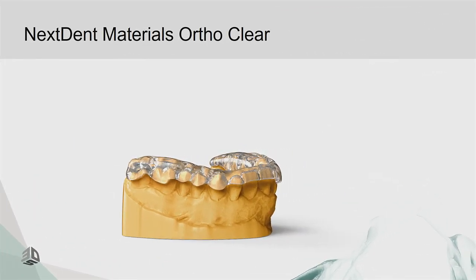Milling this takes quite some time. It's quite expensive. You have to buy expensive pucks. Printing this is the way to go if you ask me. You can print several in a row, just like the denture bases you see on the machine here. And within a matter of, let's say, 45 minutes, you're able to print 6 or 7 splints in one run. And that's, of course, way faster than any printer out there, but also way faster than milling them.